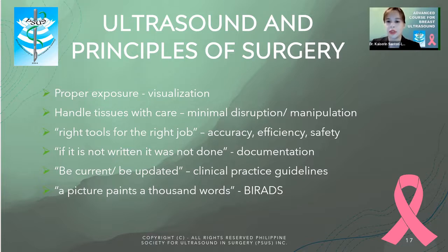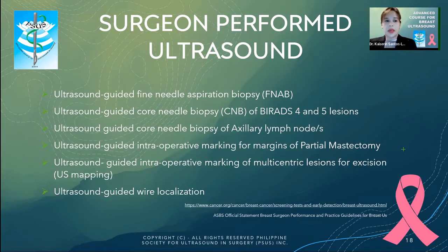The BIRADS actually will promote you reading your ultrasounds correctly, communicating these results, and looking for the proper management. Going now to our surgeon-performed ultrasound during these procedures, we have these various procedures enumerated. They are all ultrasound guided.